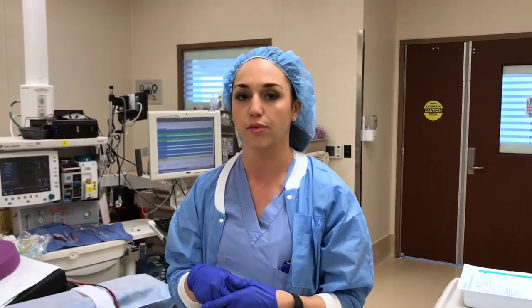Hey guys, it's Dr. Grunt again. I'm going to do a spinal video, most commonly for the tubals. Refer to the C-section video for the majority of the setup. We're just going to briefly discuss how the setup's different for a spinal procedure. Most of these are going to be tubals, cerclages, sometimes a D&C.